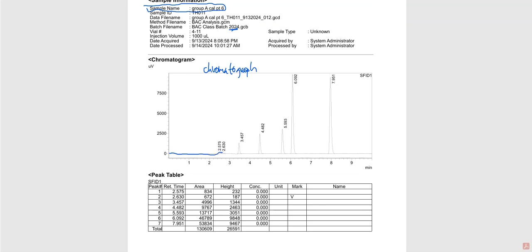And then, woohoo, we get something. And then it goes nothing coming through the tunnel of the column. And then sooner or later, something comes out of that column. So this machine is on the other end and it's counting. It's counting all of those things that are coming through. How many molecules is it counting that's escaping out of the other side? That is what this is all about.